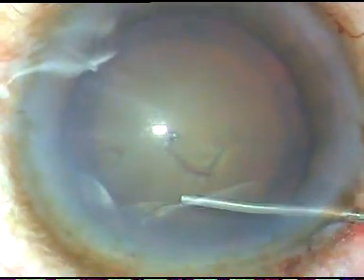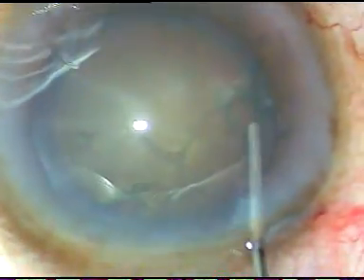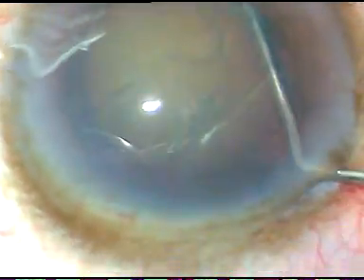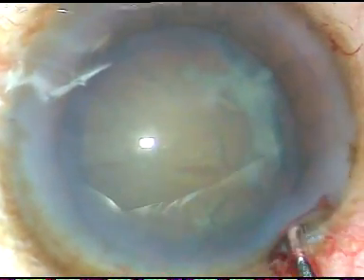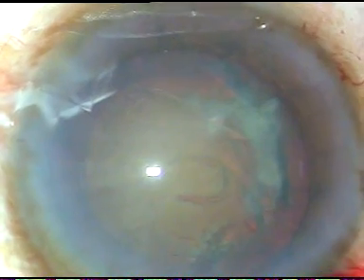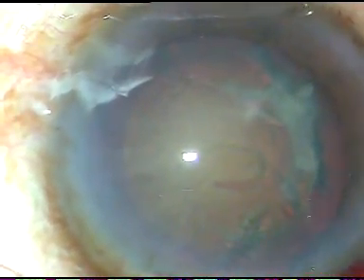Now a little bit of viscoelastic substance is expressed out and hydrodissection is done. As the fluid wave reaches the opposite equator, no more injection of BSS is done and the nucleus is gently depressed and rotated. Viscoelastic substance is then injected again and now is the time to enter the eye with the phaco handpiece. In this case I am going to use the Oertli Catarhex 3 phaco machine.